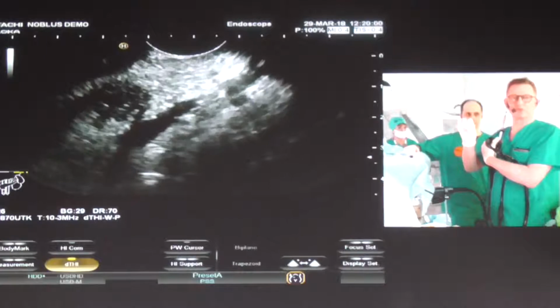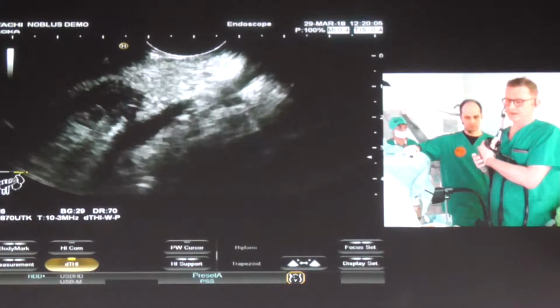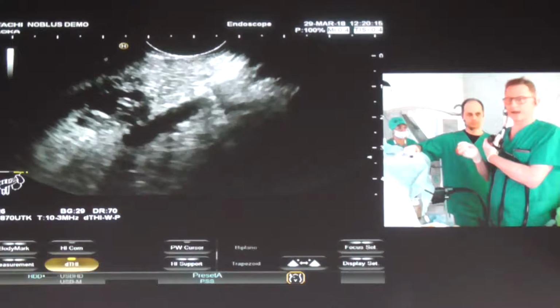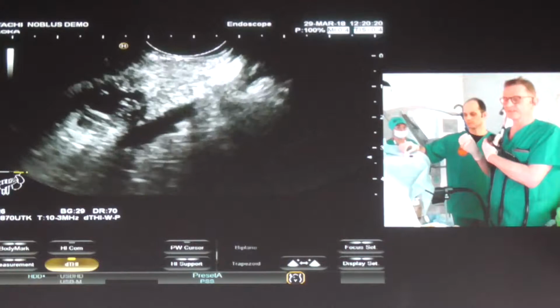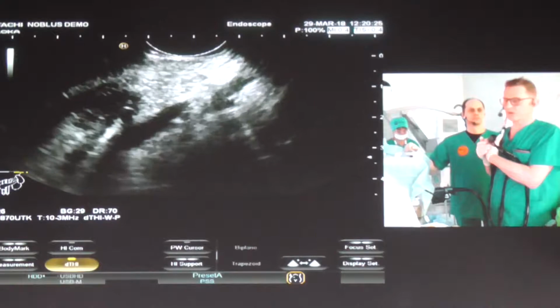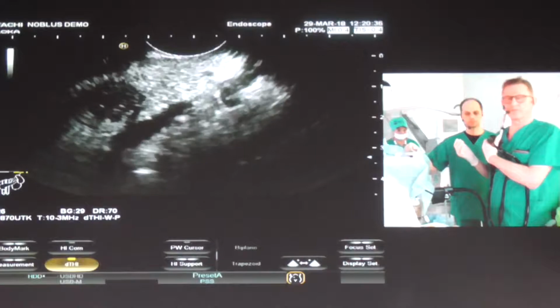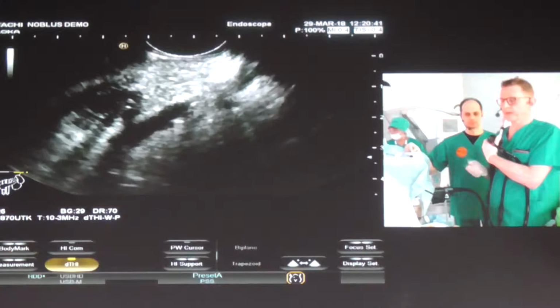And it looks actually very promising from cystic lesions. That's an interesting concept. We don't have this available right now, and I think we would try to get a specimen out with a standard 22-gauge needle. If it is a serous cystadenoma, it is in many cases unsuccessful, unfortunately, and as I told you, this is a field where we need progress in order to better define the patients and save those that don't need surgery for no surgery. But anyway, I will try and get it.